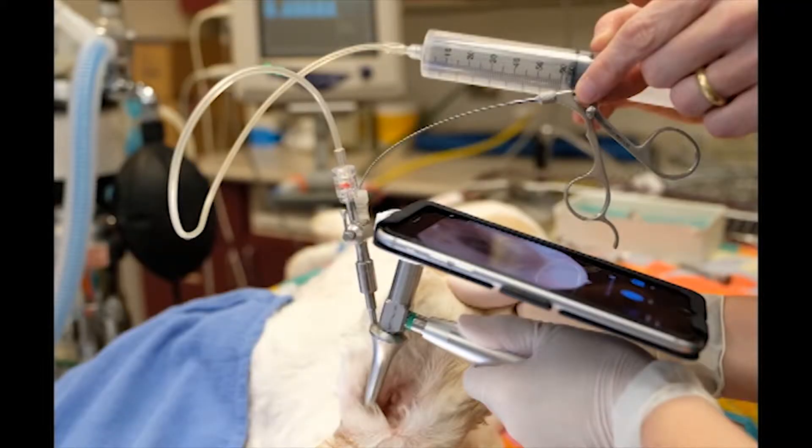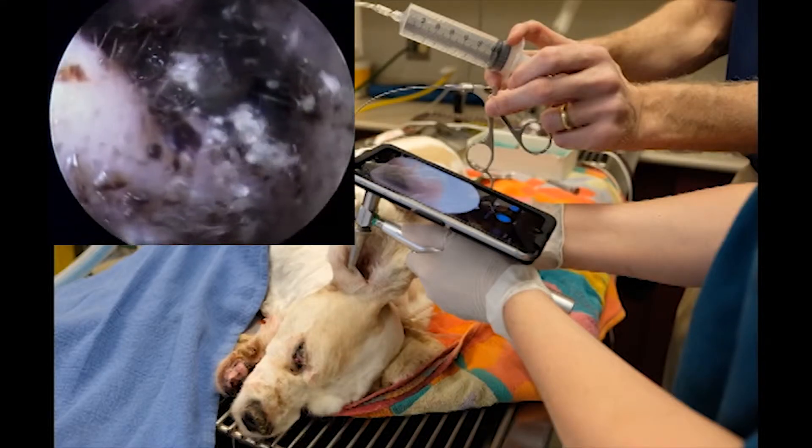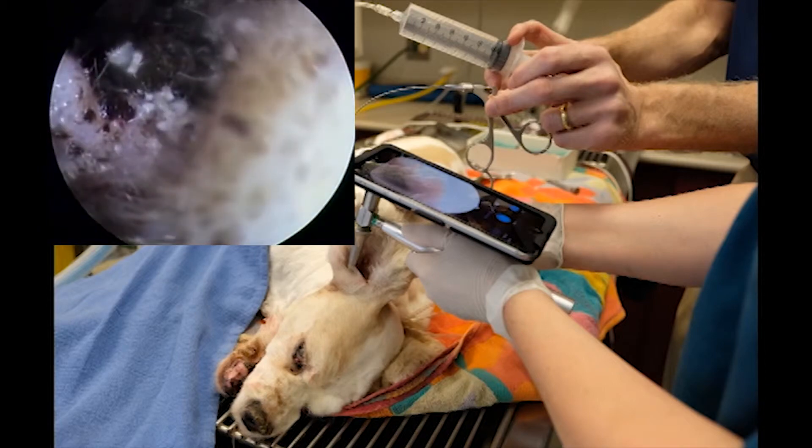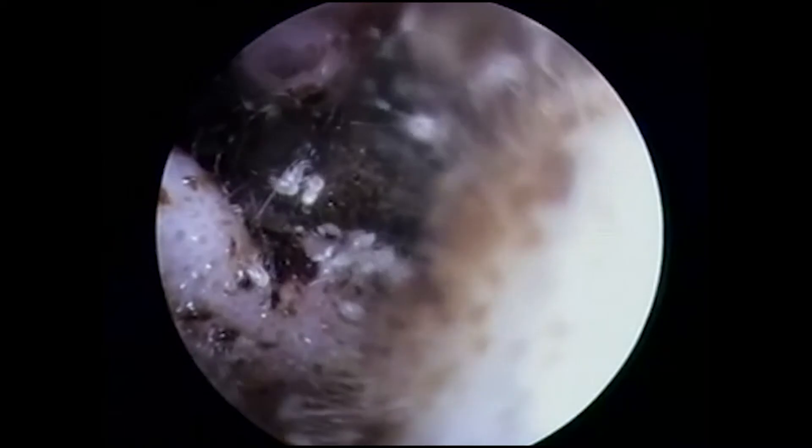You can also attach an IV bag or syringe to flush fluids through the introducing port on the scope. A grasper can be used at the same time. Images and videos are easily shared with the client via email.